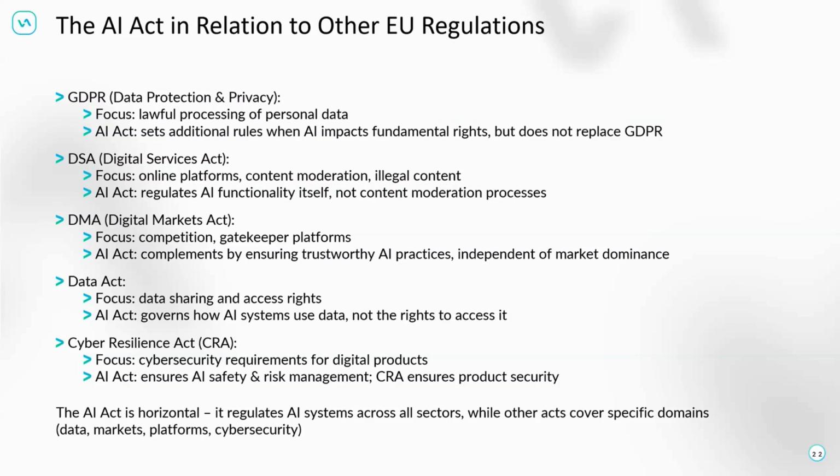From the medical device standpoint, I would say, go for the medical device. That's more relevant. That's better. However, if you can say your device is not an MDR product, like the one we had in the examples during the day, where we have a non-medical device which can be used within the pathway, or we have an animal product, and those continue or include the AI, then the AI Act will be the main driver. That will lead to additional efforts on your side that you haven't had in the past. With MDR, it's quite straightforward and a quite simple path.